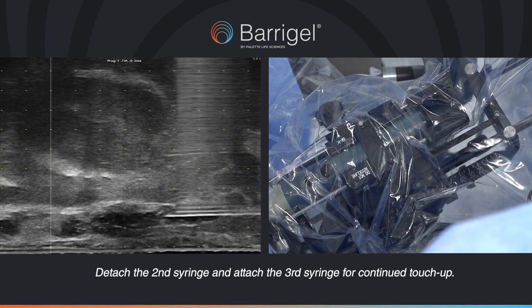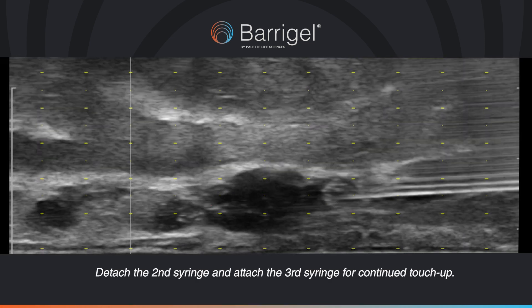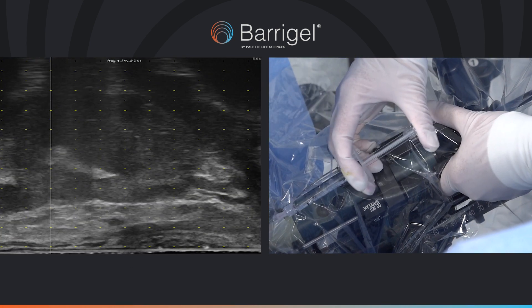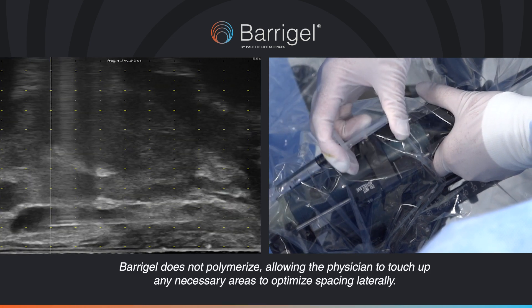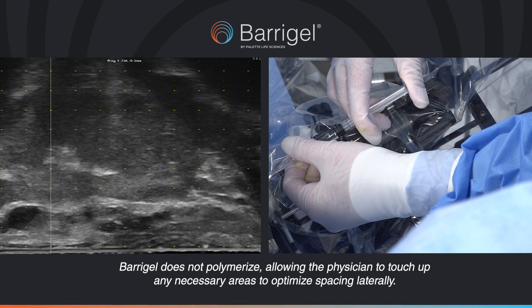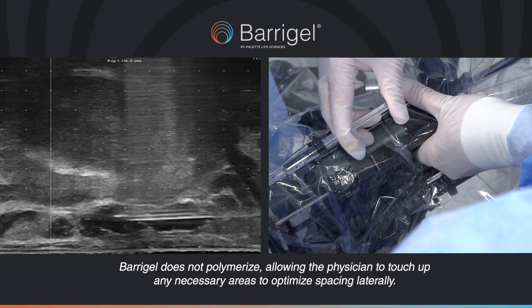Detach the second syringe and attach the third syringe for continued touch-up. BaraGel does not polymerise, allowing the physician to touch-up any necessary areas to optimise spacing laterally.